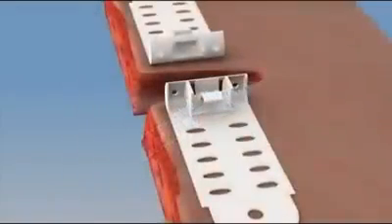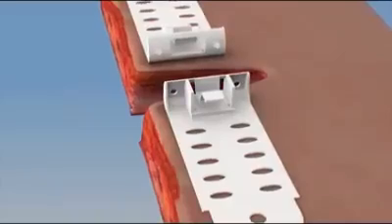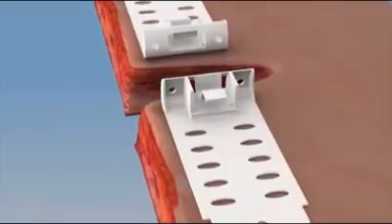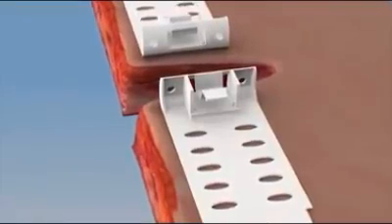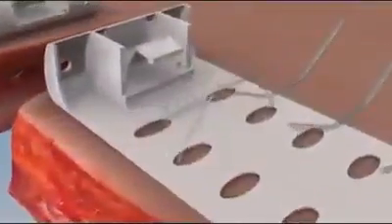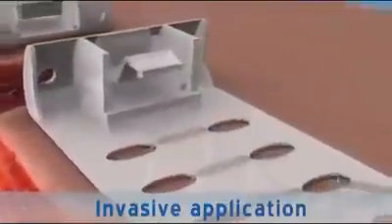The Top Closure 3S system can also be attached to the skin invasively using staples, sutures, K-wires or a combination of the above during surgery. The plates are secured to the skin by application of staples.